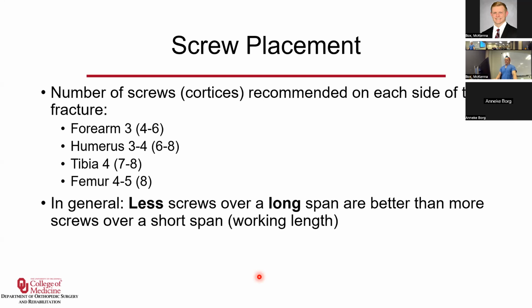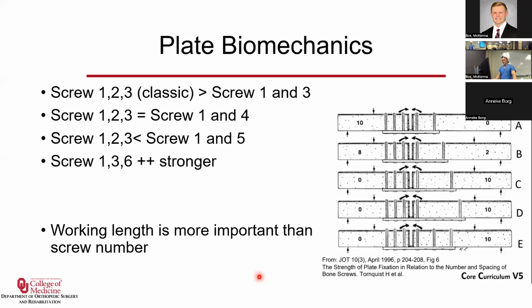Number of screw placements, this is something that y'all can go over later. Basically, going back to working length, fewer screws over a long span are going to be better than having a lot of screws in a really short span, as I was talking about.